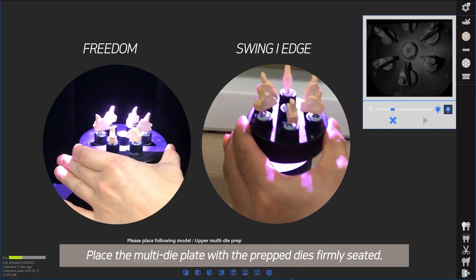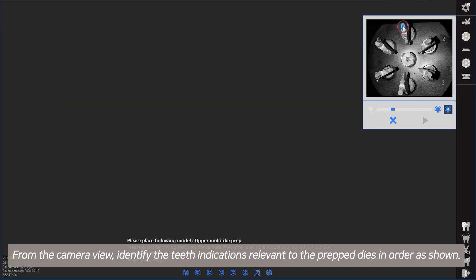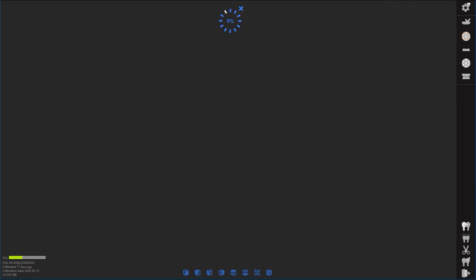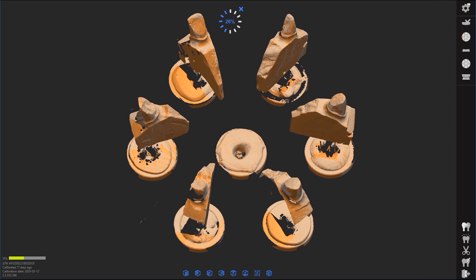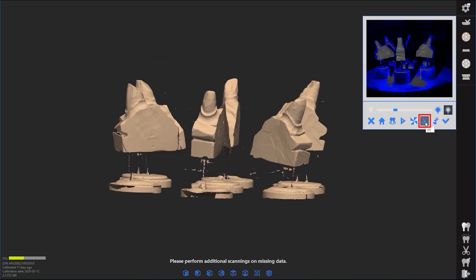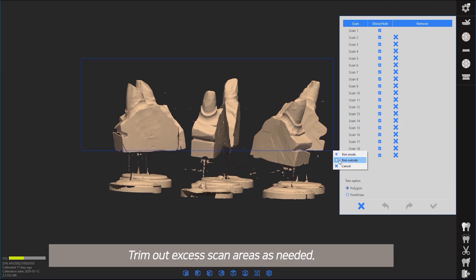Place the multi-die plate with the prepped dies firmly seated. From the camera view, identify the teeth indications relevant to the prepped dies in order as shown. Trim out excess scan areas as needed.